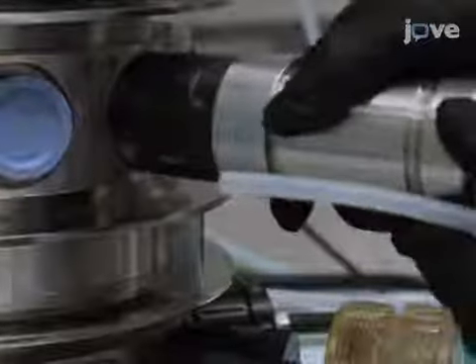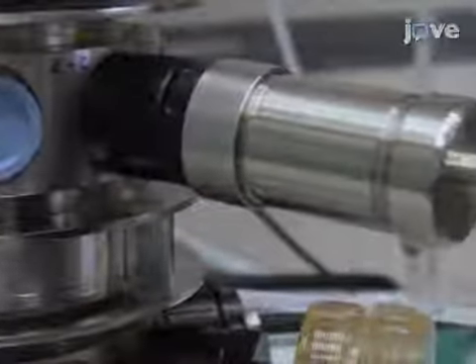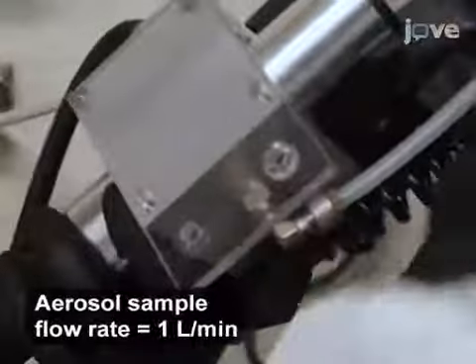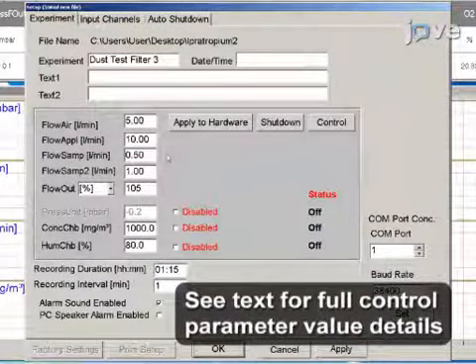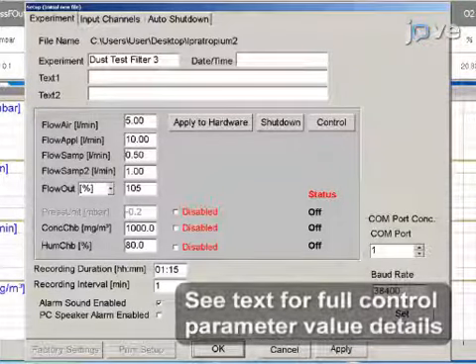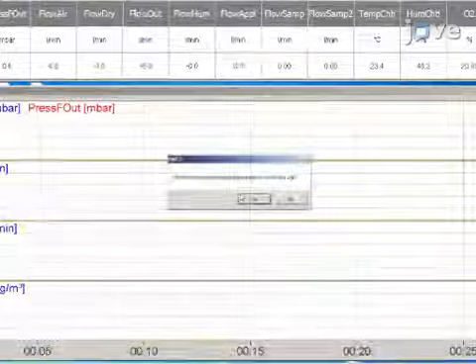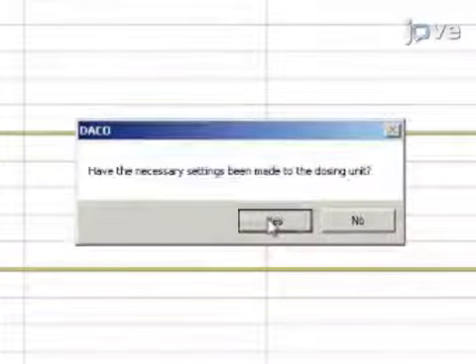Connect the inlet of the cascade impactor to a central aerosol plenum sample port and the outlet to a vacuum source. To monitor the aerosol content of the inhalation unit, connect the inlet of the real-time aerosol monitor to a central aerosol plenum sample port and the outlet to a vacuum source. Set the process control parameters to the appropriate values according to the number of animals to be connected to the inhalation unit and begin the delivery of the aerosolized drug of interest.